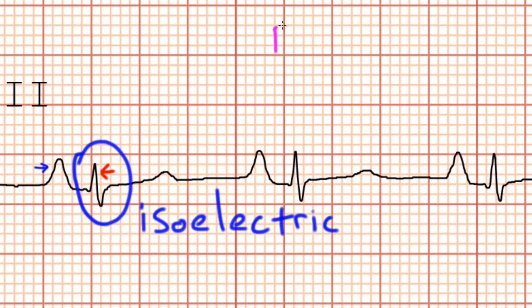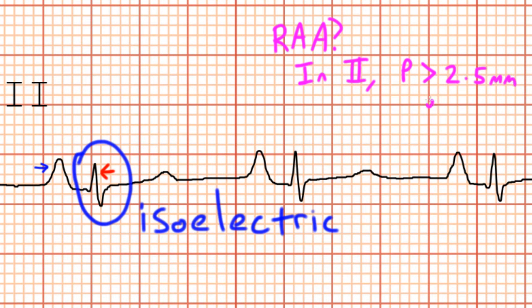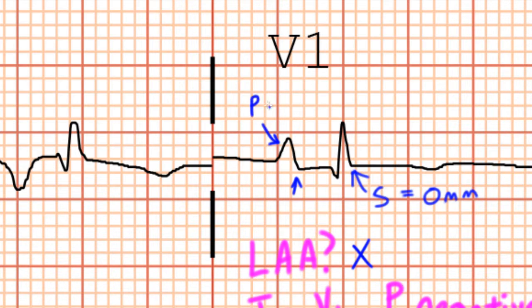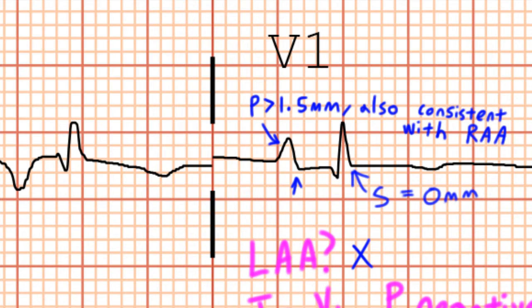For right atrial abnormality, we look in lead 2 for a P-wave that's taller than 2.5 millimeters. Looking here in lead 2, we can see that this P-wave is quite tall — in fact, it looks like it's taller than the R-wave. So I'm going to say this is right atrial abnormality. Also, looking in lead V1, the P-wave is taller than 1.5 millimeters, which is that optional criteria, also consistent with right atrial abnormality.